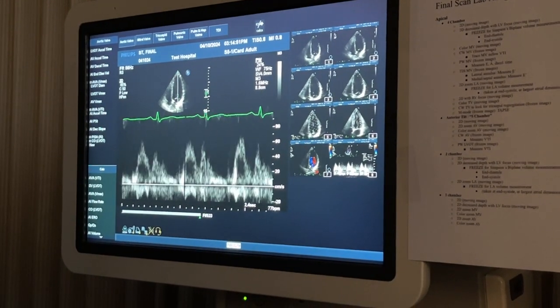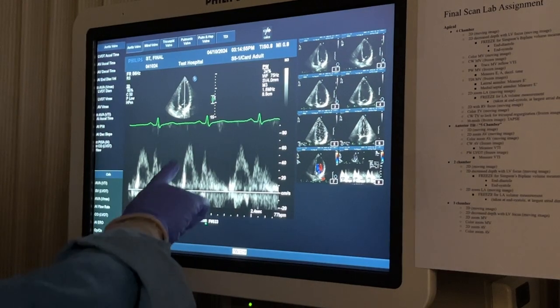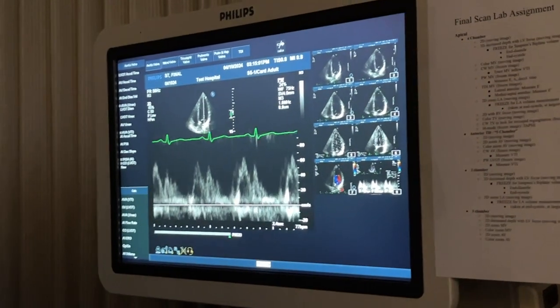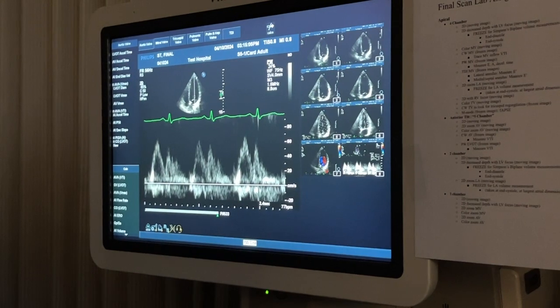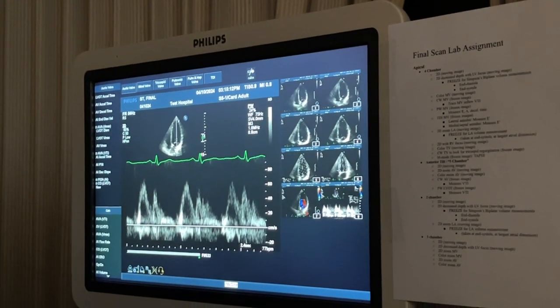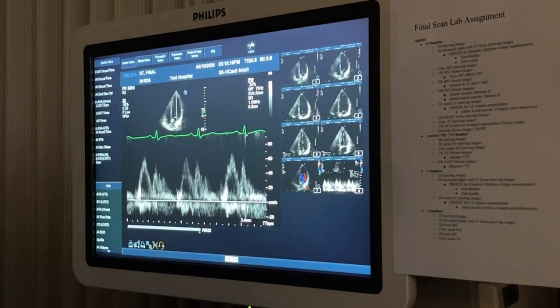I like that. Okay, so these three are my measure ones. I'm going to measure this one right here, actually. I want one that doesn't have a fuzzy A wave. Because you see how we've got, yeah, every third one is kind of like that with inspiration. It's just the rate that she's breathing normally. Yeah, I would say I like this one. I believe this one.